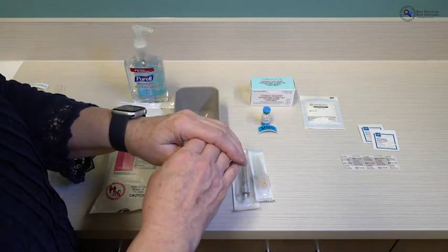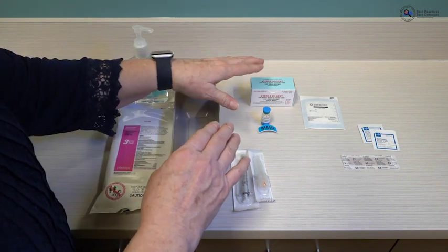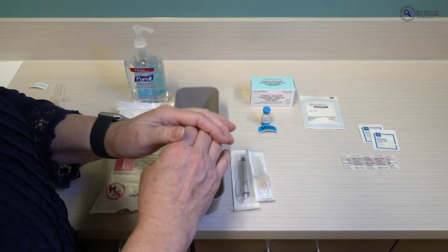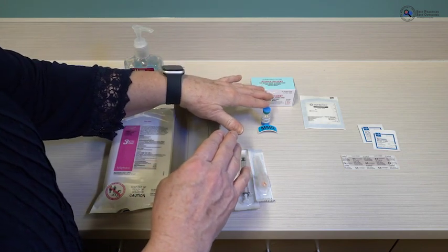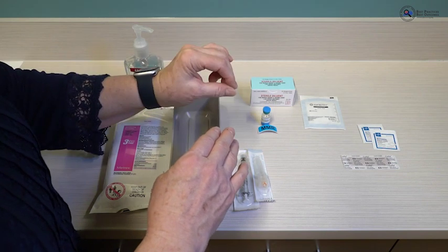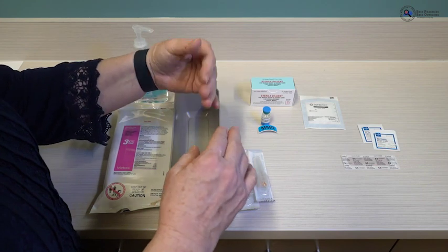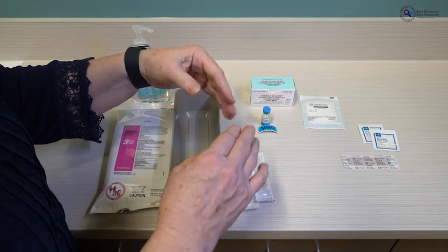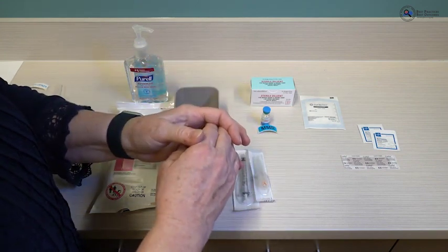Follow your protocols. If you have any questions, all of that is outlined in the prescribing information or the package insert, and you can use that as a reference. Generally speaking, once you remove a live virus vaccine from its controlled environment, you prepare it and administer it within 30 minutes. If it extends beyond 30 minutes, go back to your protocol to see whether you need to discard that vaccine or how much more time you have.